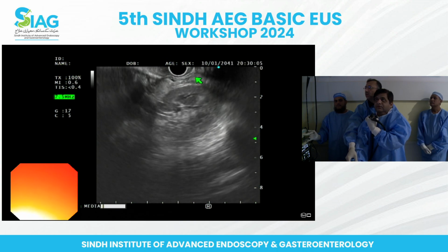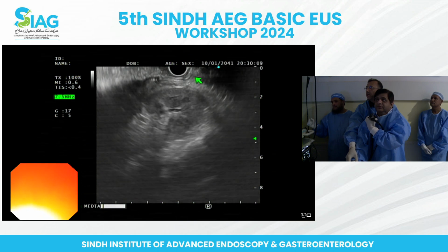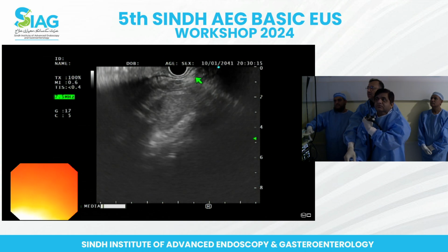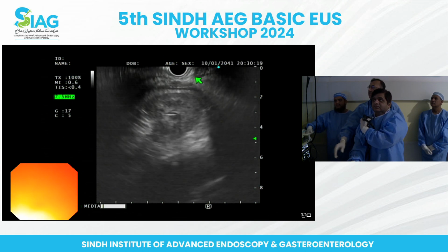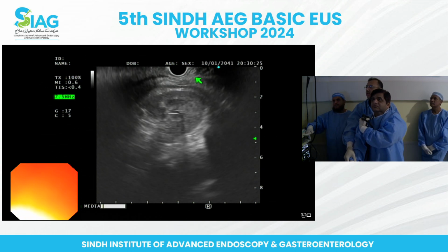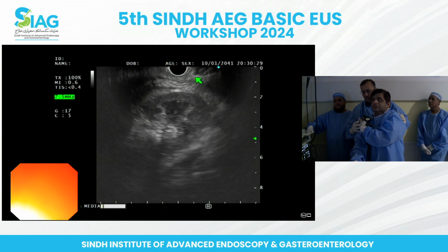You see, now you start to see the top of the kidney. Okay, and just a jiggling movement. Now small, small movements, not too much. Small movements. Okay. Now as such, we don't see something coming in between the spleen and the kidney. Slow, subtle movements. Easy movements, slow.